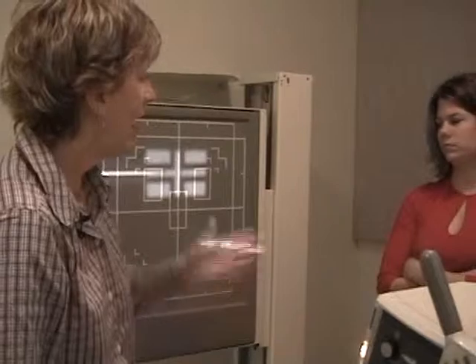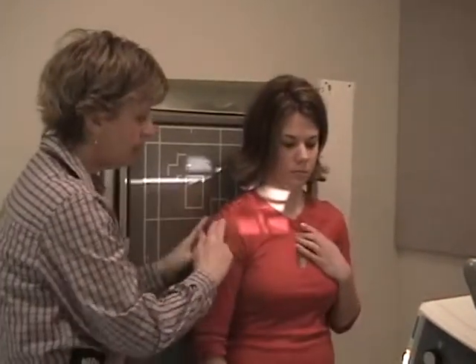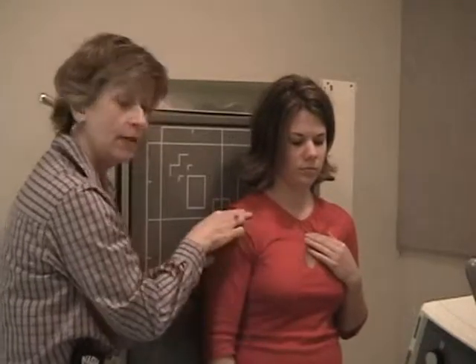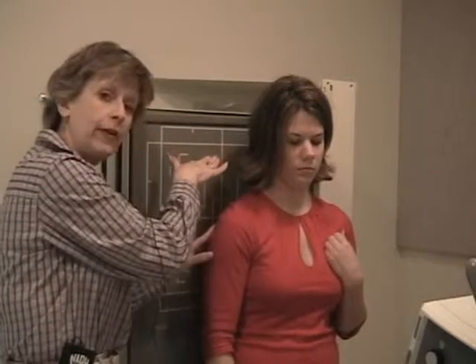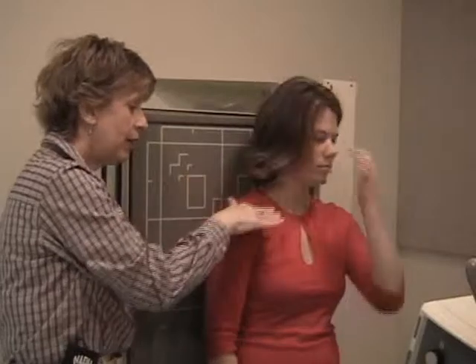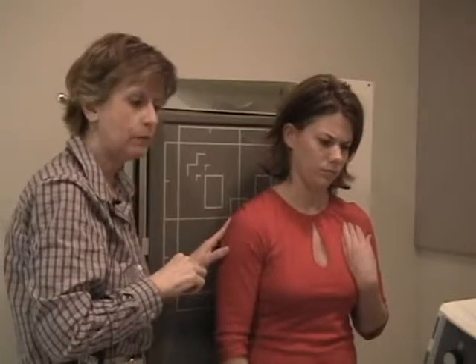The purpose of that, Drea, can you come here, is to take the clavicle. It'll actually minimize the natural S shape of the clavicle. It minimizes the S shape, and it throws the clavicle superiorly, trying to get the clavicle away from underlying ribs in the apices of the lung. So a 15-degree cephalic tube angle.